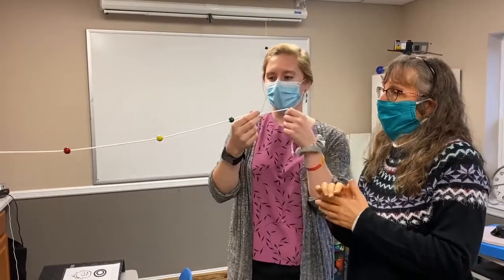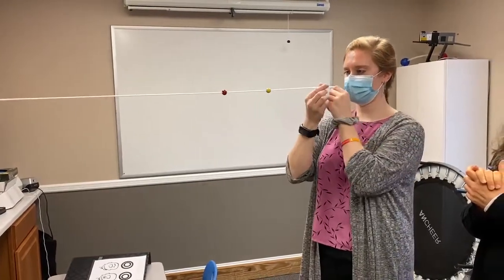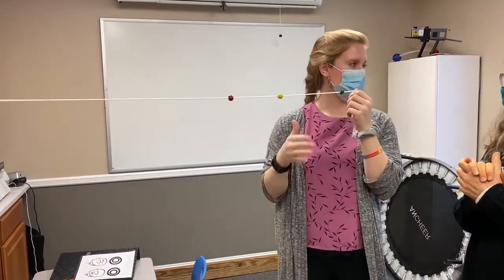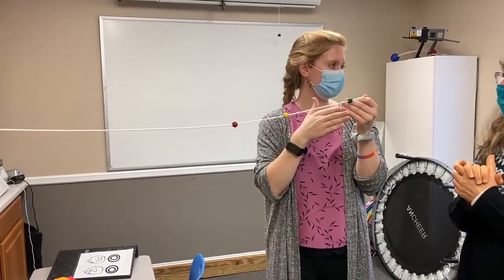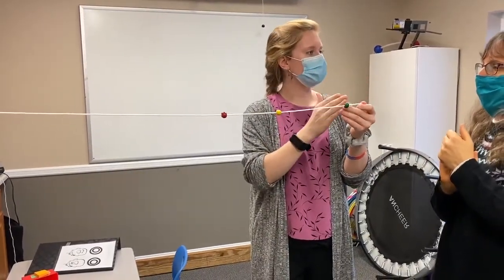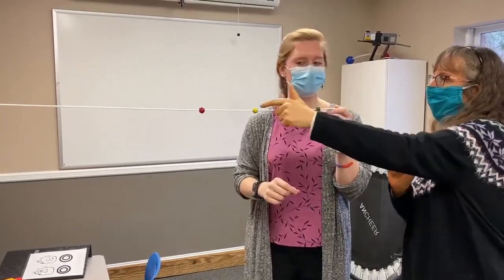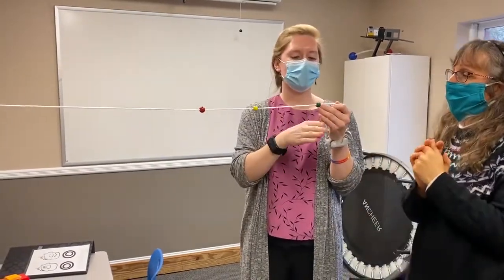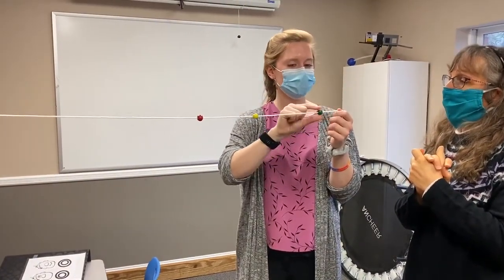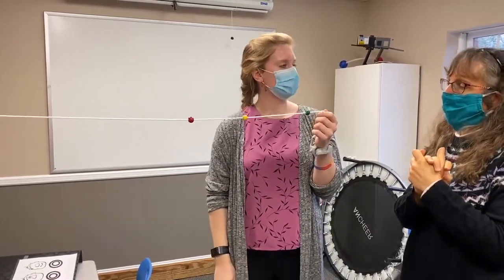The ultimate goal is to get the beads to about two inches from you, really crossing and looking from bead to bead, so your eyes can jump, move, and cross all on their own. Move the beads closer when you're able to keep them single and maintain that cross — two strings going in, two strings leaving. That cross should always be directly on the bead. If it's in front of the bead, move it out; if it's behind the bead, move it in, so they're crossing right at the bead every time.